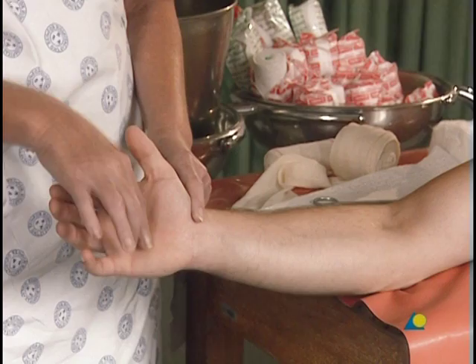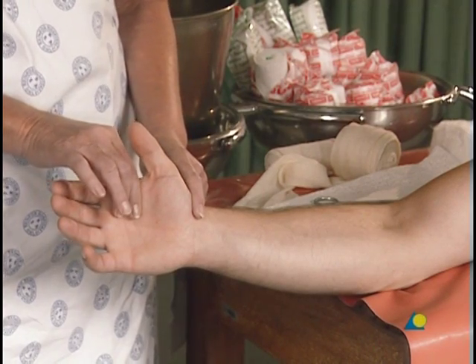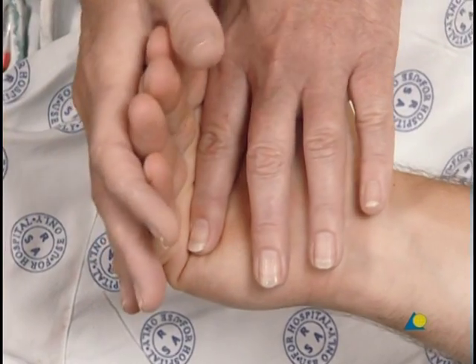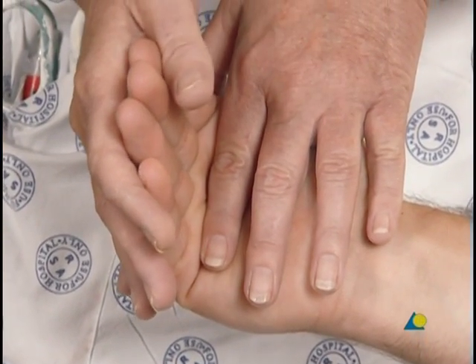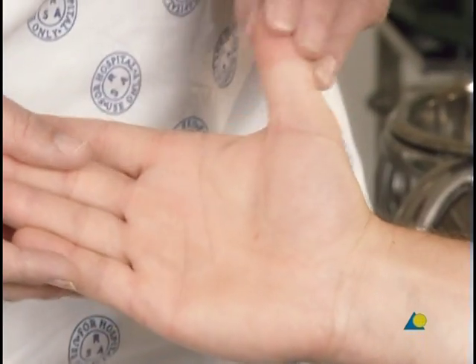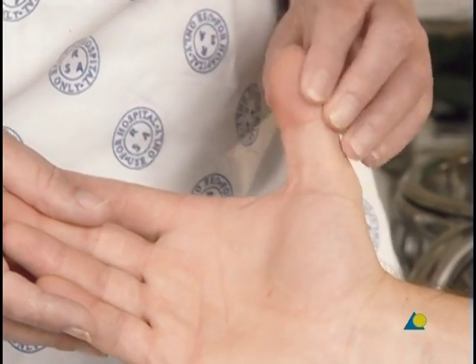The distal border is located no lower than the distal palmar crease, so that the patient is still able to flex the MP joints to 90 degrees. The volar slab should allow the patient continued use of the thumb, so the thumb should remain open.